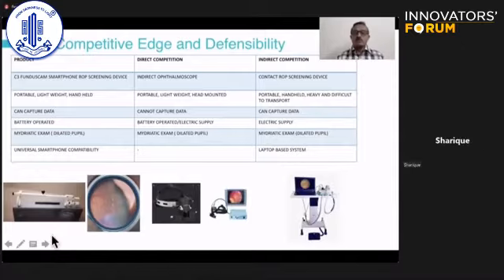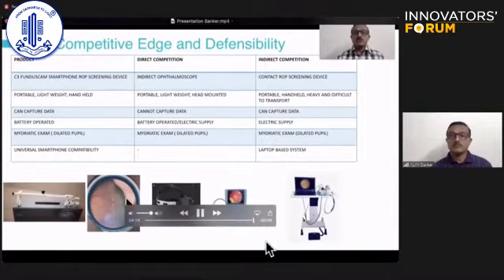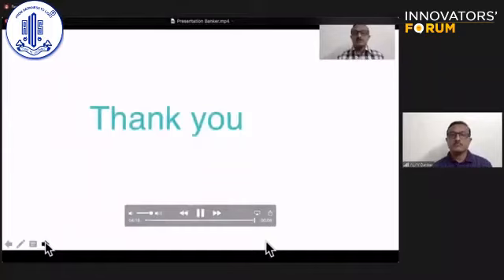Through this, we will make ROP screening more accessible even in the rural areas. Thank you very much.